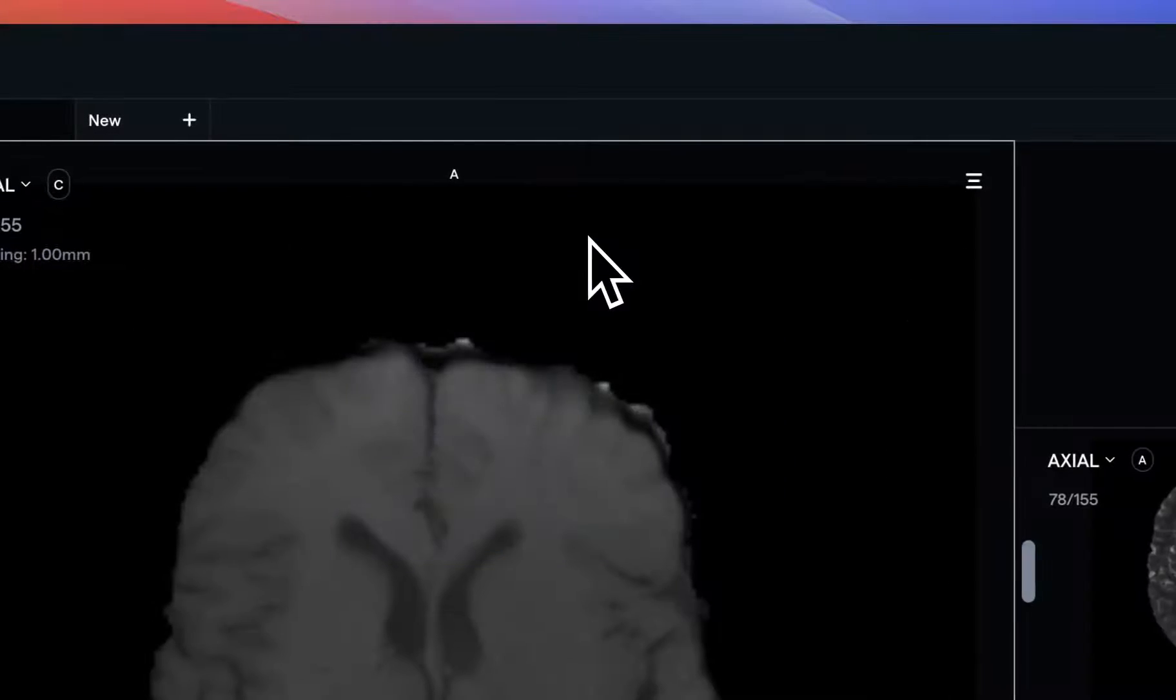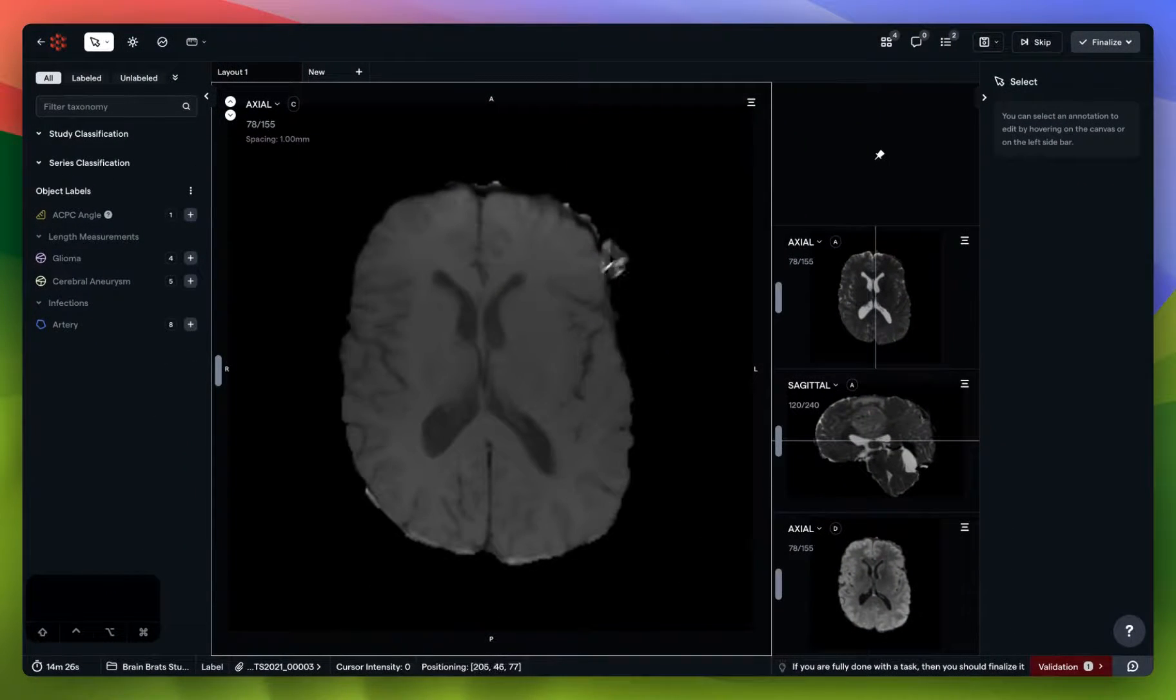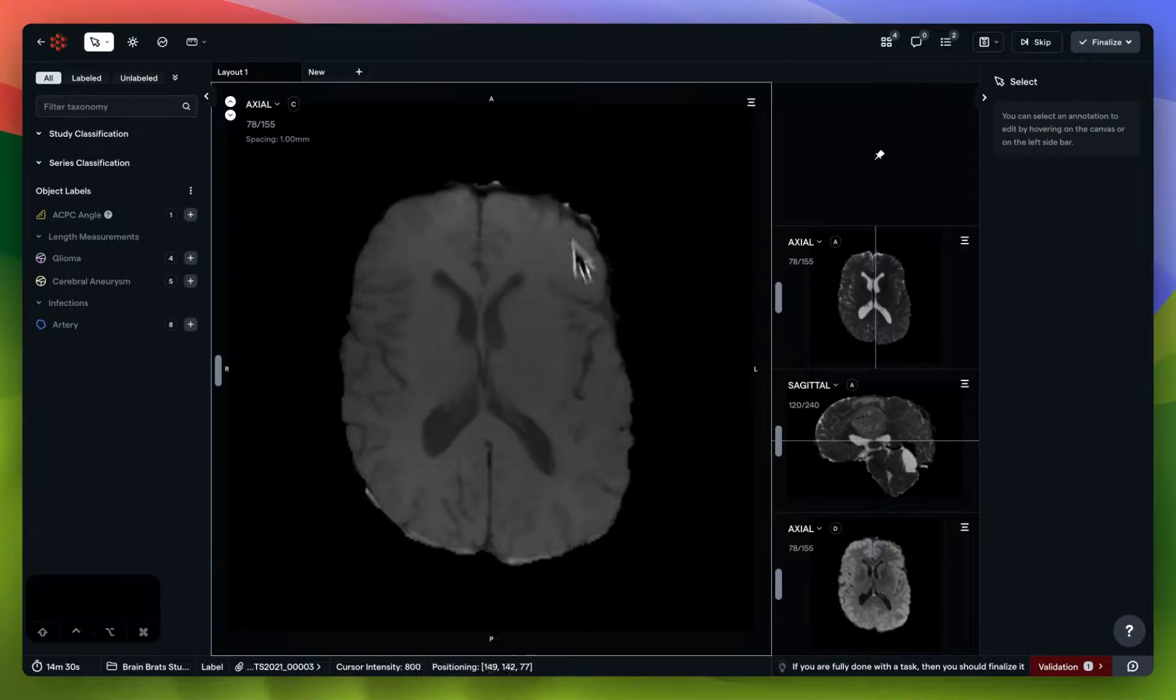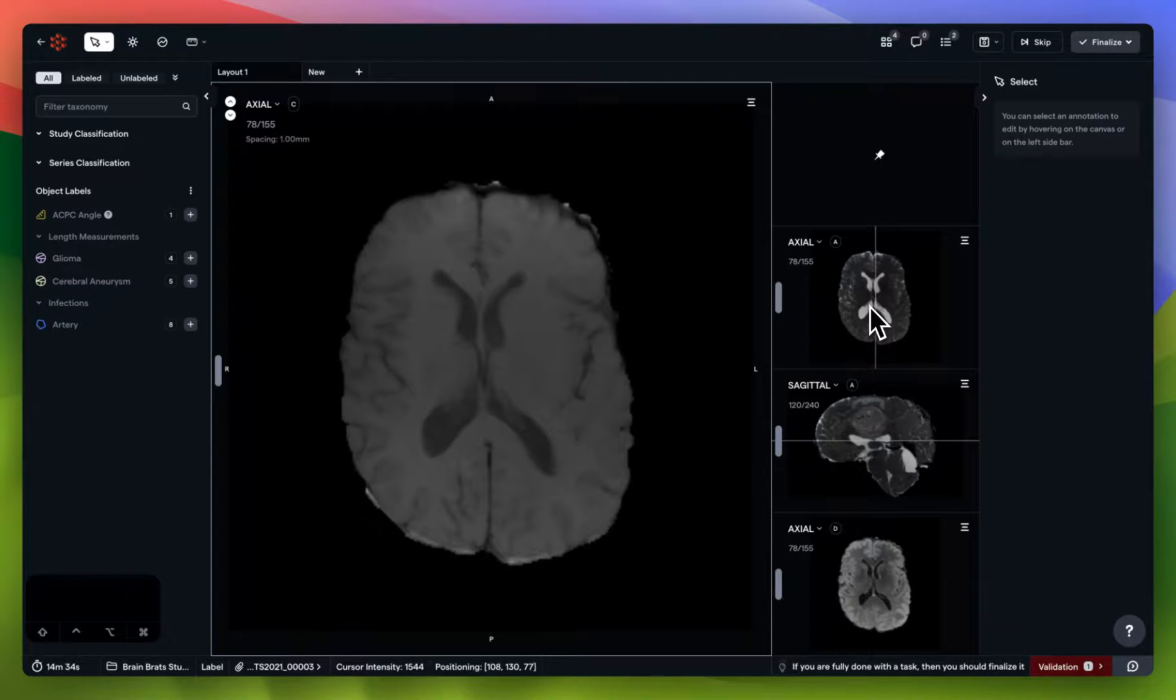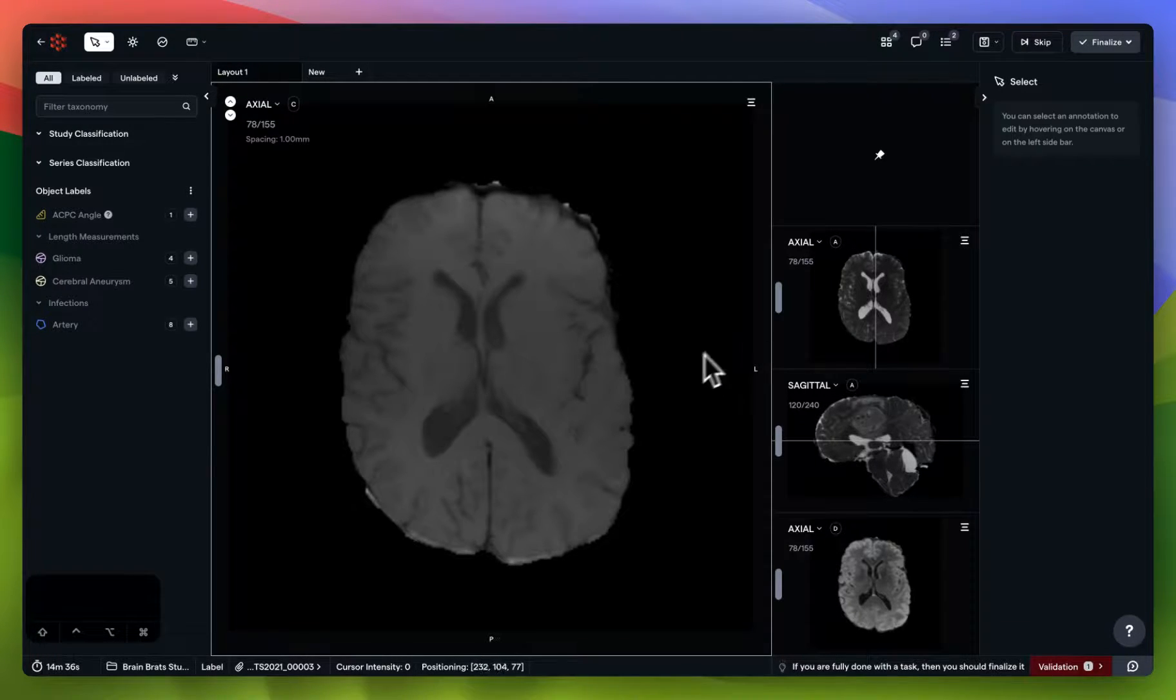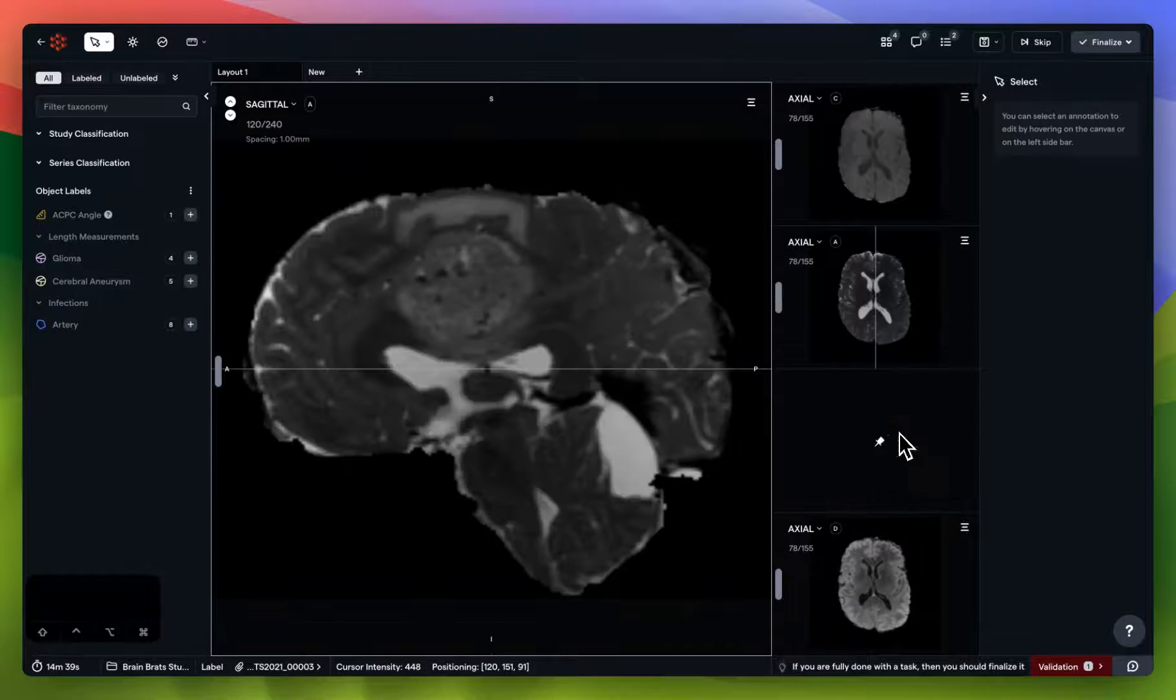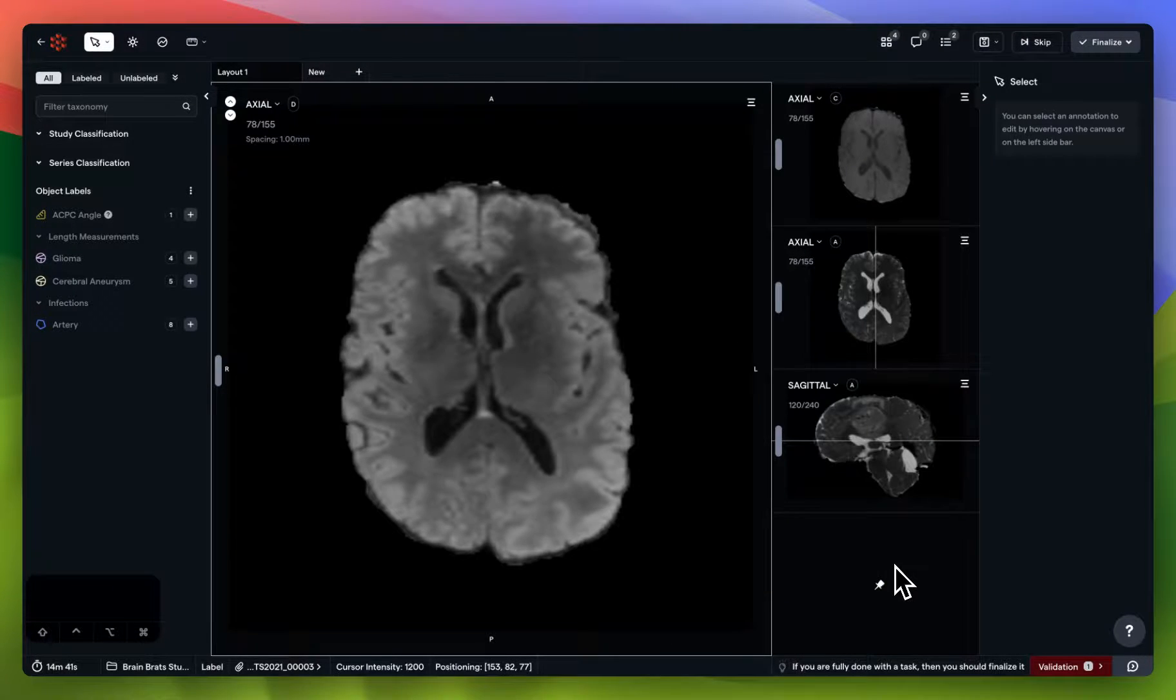Namely, maximizing a viewport, which allows you in a 2x2 view or 2x3 view to centralize a single viewport and access any other ones you'd like for reference. Please note that when you have a viewport maximized, you can double-click on any other viewport available to swap between them.